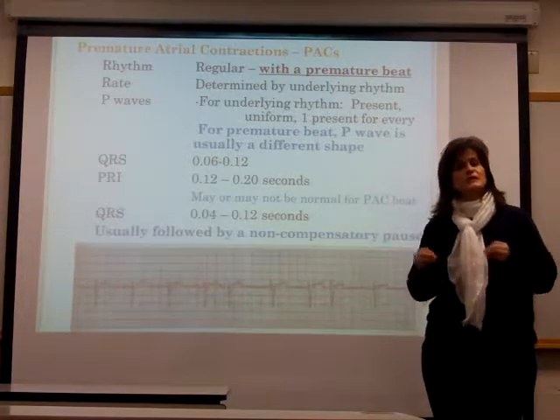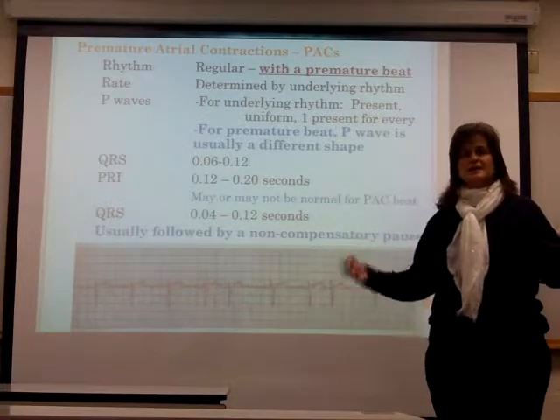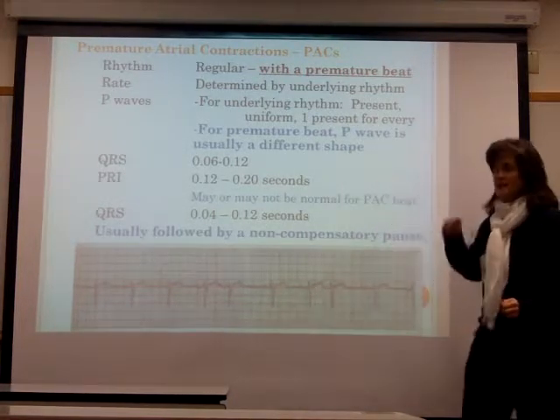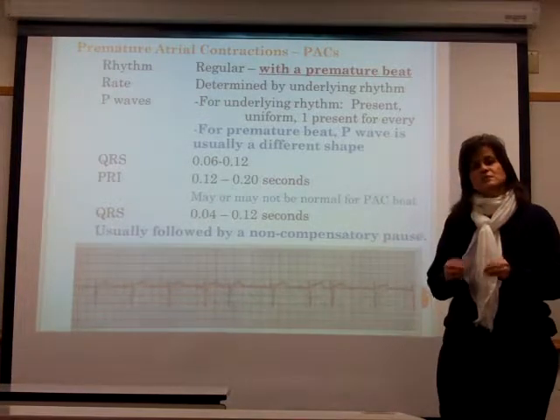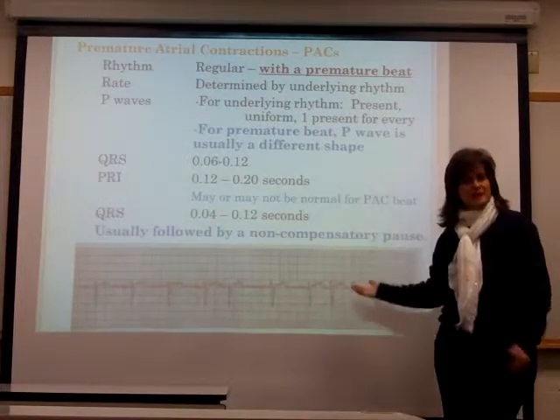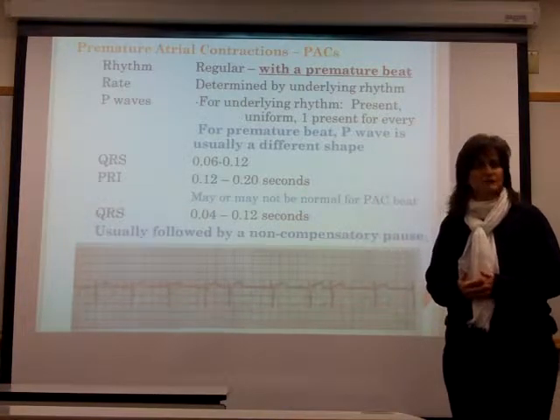So you would treat it like the ST segment abnormalities. You would never tell me someone has ST segment depression and that would be what was called their underlying rhythm, because that makes no sense. It's the same kind of concept with premature atrial contractions. These are anomalies or blips on the screen that we need to address, but in order to tell me the full picture coming from the EKG interpretation, you have to tell me what the underlying rhythm is.